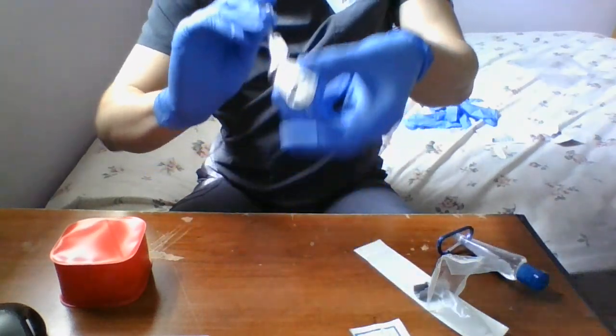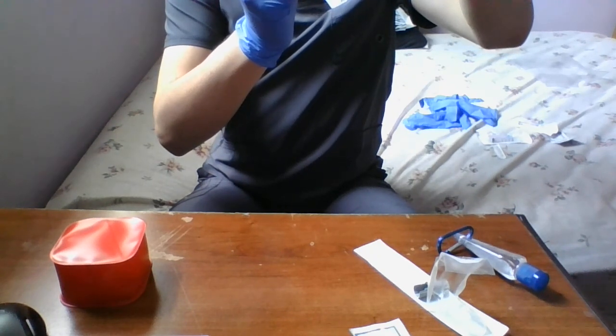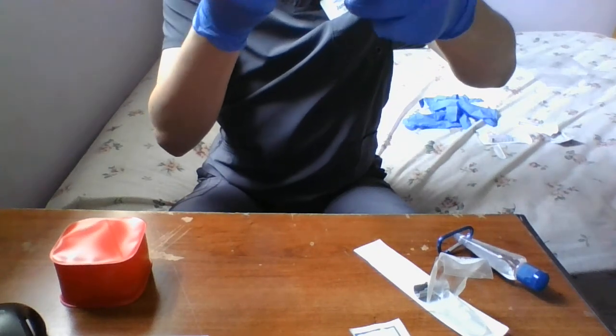And tilt it up now, and draw back 0.6 mLs. It is perfect, no air bubbles, right at 0.6 mLs.